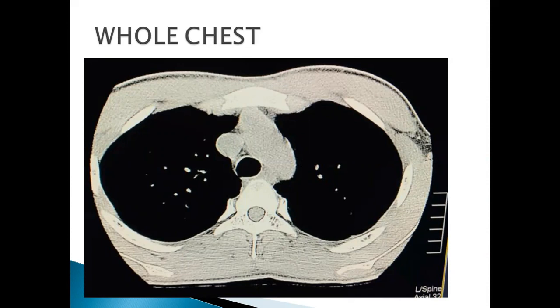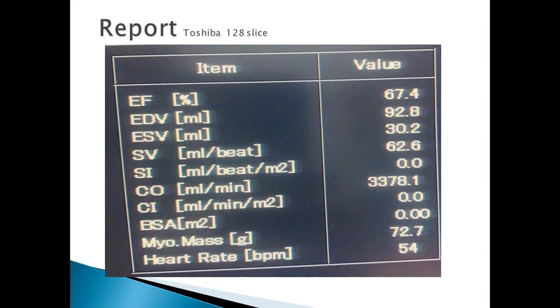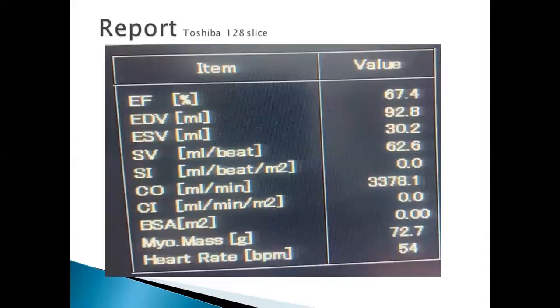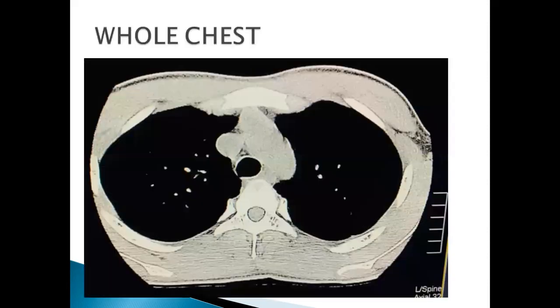Make sure then that you send to the radiologist after you are done to make sure that everything is fine. So when you get your report, when you get also the report for the calcium score, these things are sent to the radiologist. However, the radiologist system is much more complex, and he or she is able to get more information, and they're able to obtain more data than the workstation that the radiographer has. But basically, you are still able to get on your workstation all this information here.